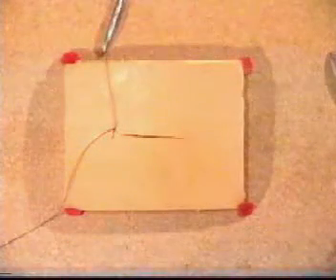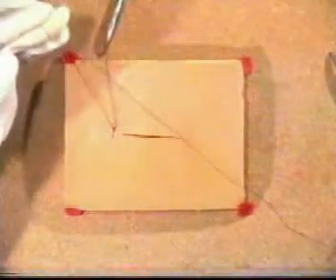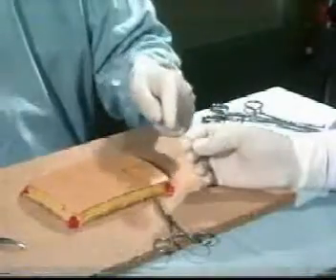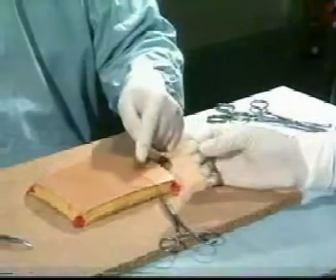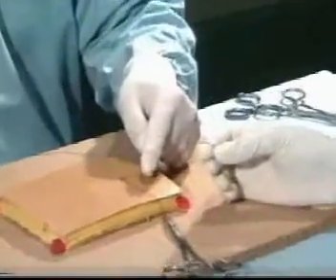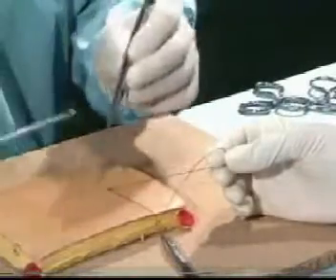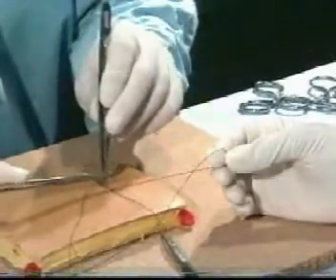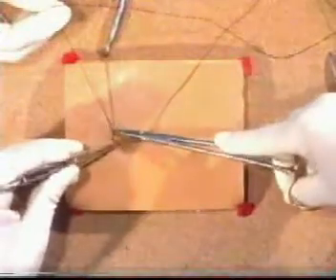Grasp it in the tip of the jaws and place to one side. Then pass the other length of the suture to your assistant and make sure that they hold it the right distance from the wound. Not too close and not too far away. Then continue suturing.